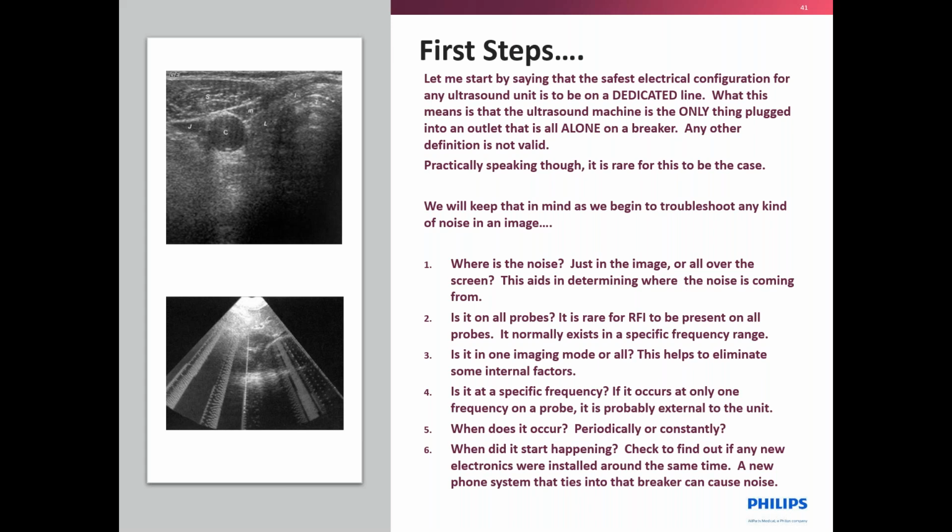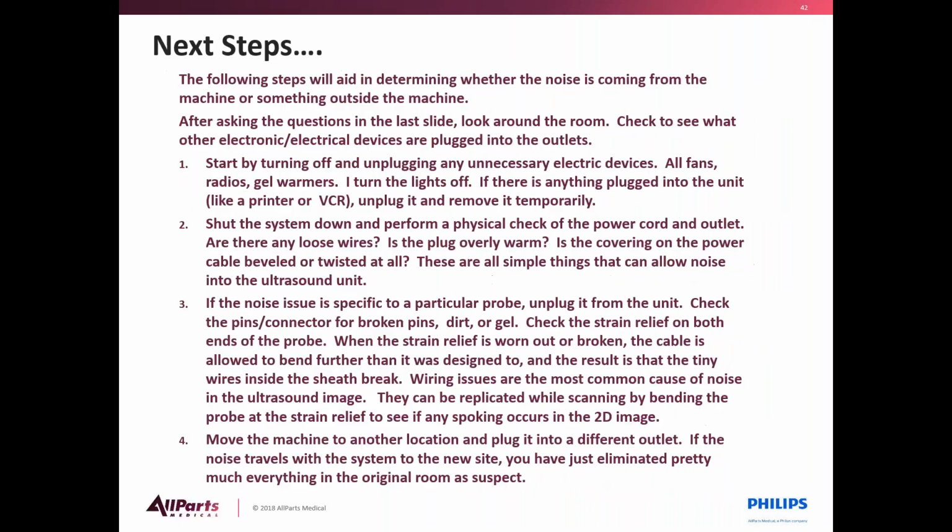Check to find out if any new electronics were installed around the same time. A new phone system that ties into that breaker can cause noise. There's so many other things that can cause noise that you want to walk into that room and just take a look around to see if there's anything there that you see that could be interfering with your ultrasound system.